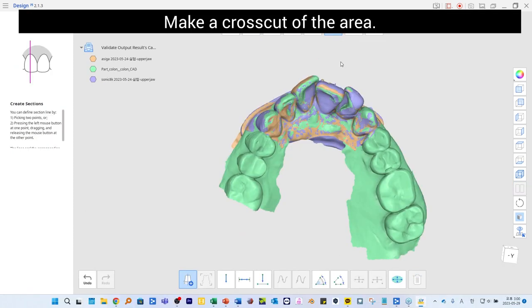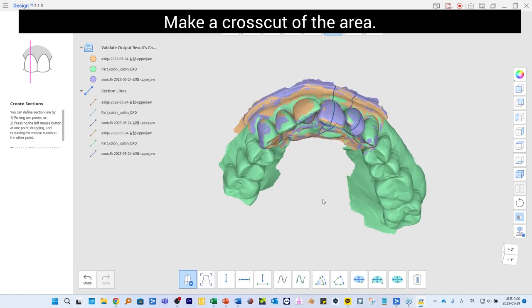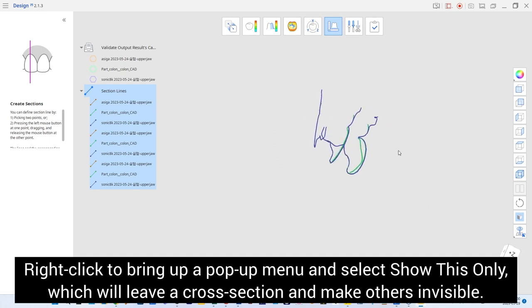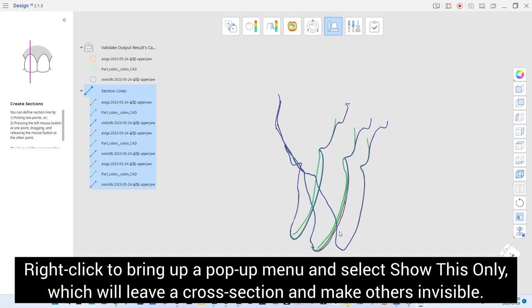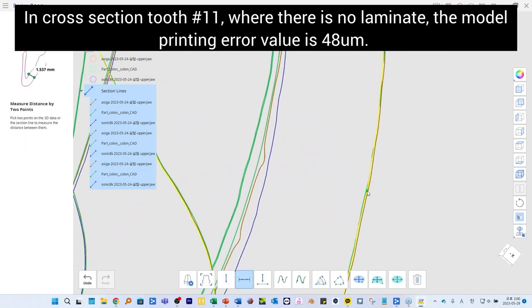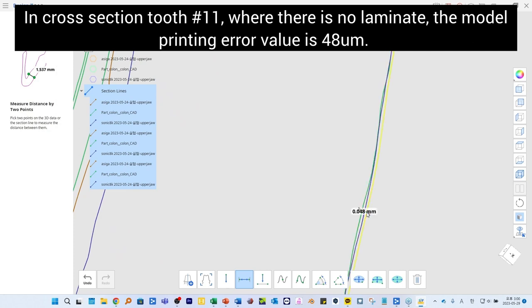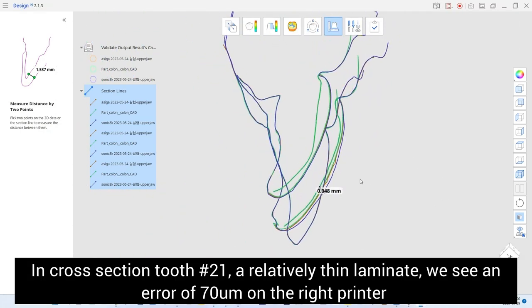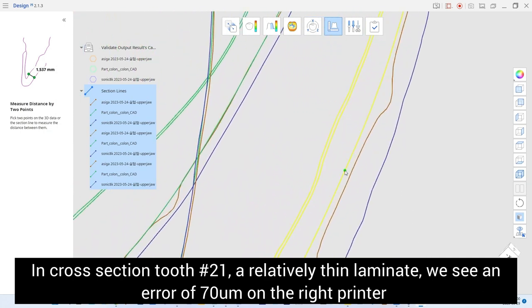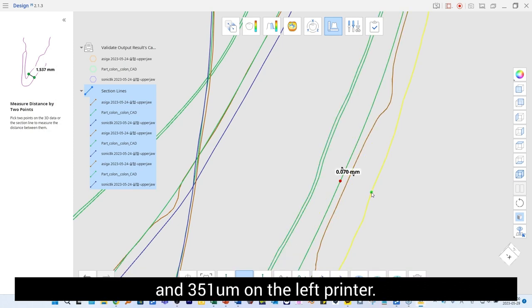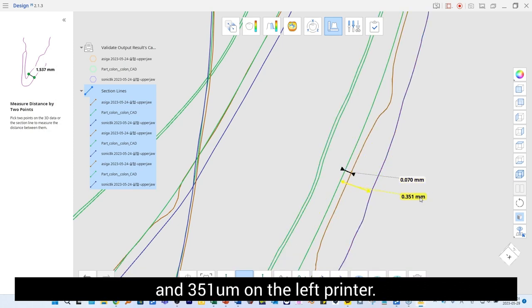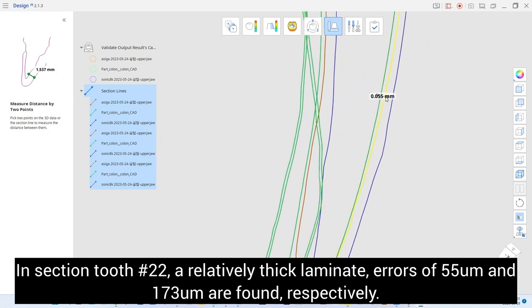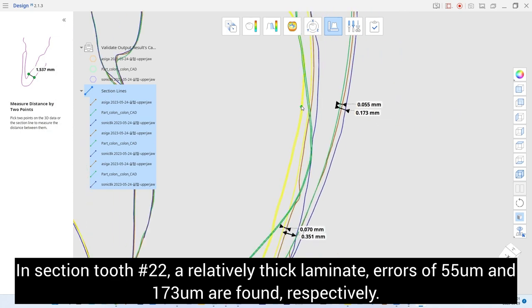Run Measurement mode and make a cross cut of the area. Right-click to bring up a pop-up menu and select Show This Only to leave the cross section visible. In cross section, tooth number 11 — where there is no laminate — the model printing error value is 48 micrometers. In cross section, tooth number 21, a relatively thin laminate, we see an error of 70 micrometers on the right printer and 351 micrometers on the other printer. For tooth number 22, a relatively thick laminate, errors of 55 micrometers and 173 micrometers are found respectively.